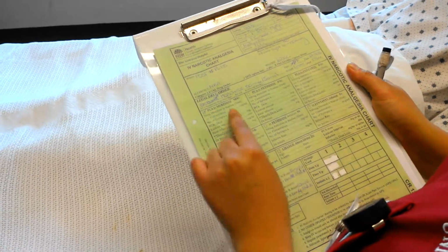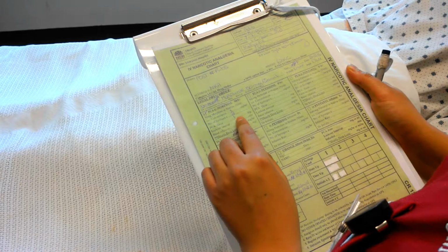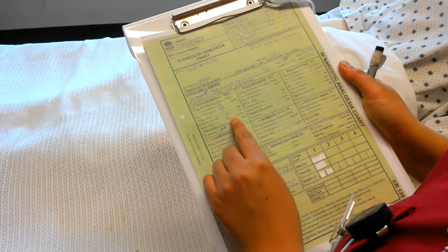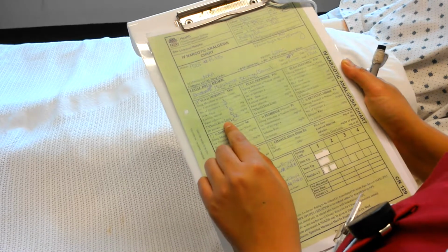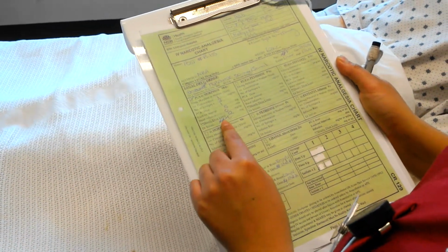So concentration is 1 milligram per mil. Number of syringes is 3. PCA dose is 1 milligram. The lockout interval is 5 minutes. Basal infusion is 0 milligrams per hour. The hourly dose limit, however, is just 12 milligrams, and it's been signed by the doctor.